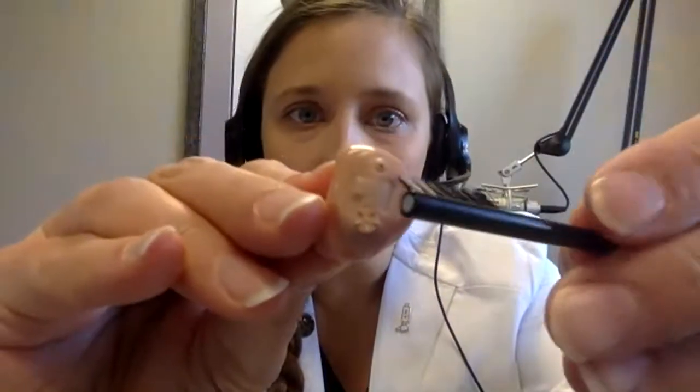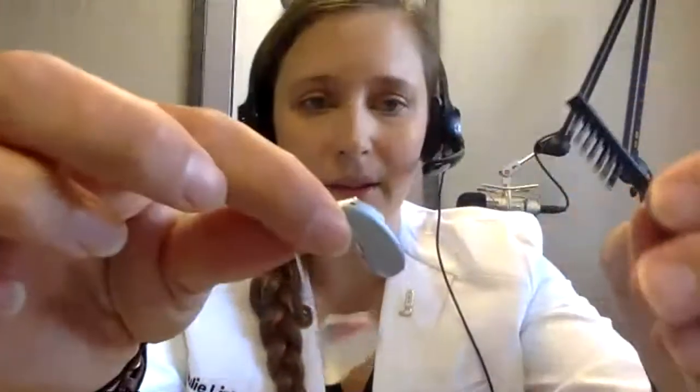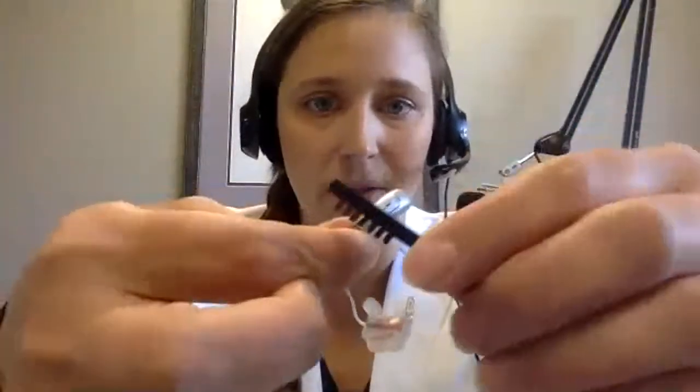If your devices are still not working after you change your battery, we talked about in part 1 last week, regular cleaning. Go ahead and do that and take a little extra attention to cleaning off those little microphones, right? So if this gets plugged up here, the sound's not going to be able to get through. And so that's pretty typical when we have any different style of hearing device. Just clean off those microphones with your little brush, or again, that soft bristle toothbrush is especially helpful if it's not working properly, if it's weak or it's dead. It just helps you get in there, make sure you get the right spot, just in case you're not confident of where that would be.